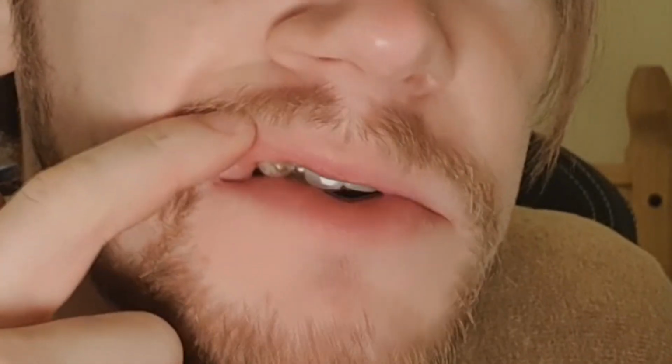I've been a little bit conscious of this big one because this is one of the ones that fell off and they reattached it. But the second attempt wasn't that great. The composite material didn't fill the template properly, I don't think. And I've ended up with holes in both of the attachments. I've actually had to pick food out of these attachments sometimes because there's crevices in them that shouldn't be there. So when I go back in January, I might say, is there any chance you can get rid of this and put a proper one on and replace it, because I don't like it. We'll see what they say.